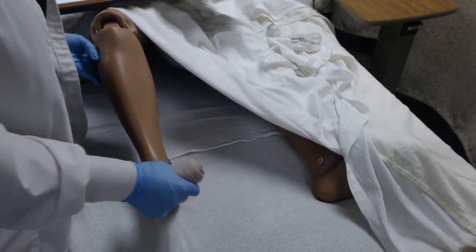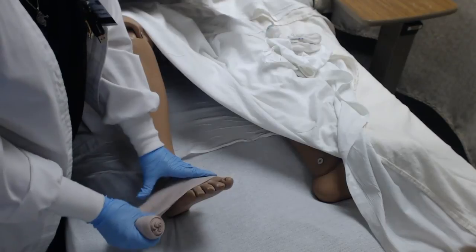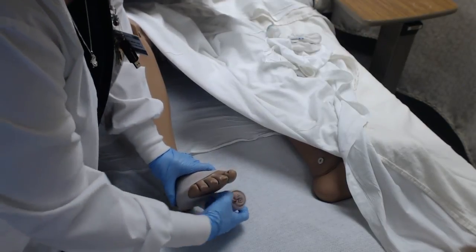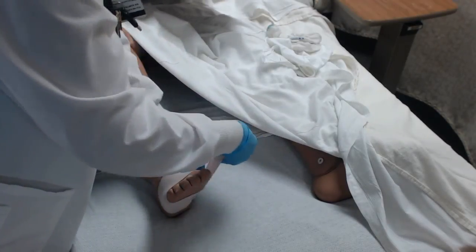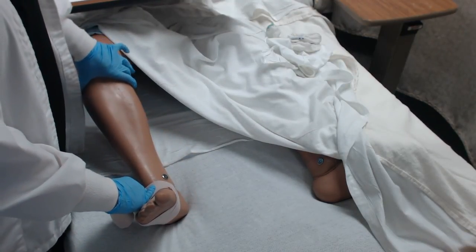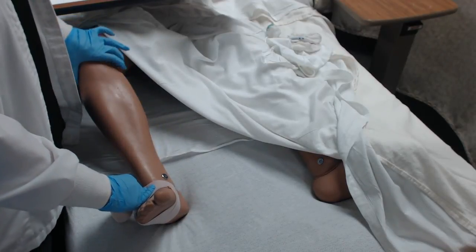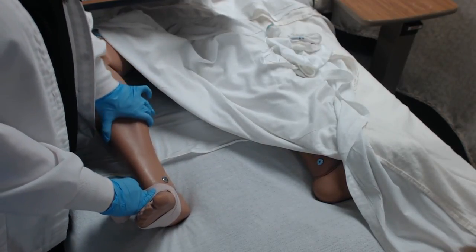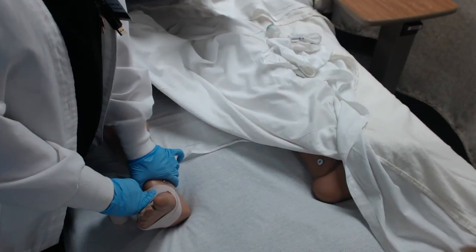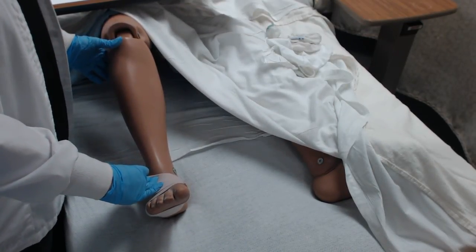So the biggest and most important thing you want to remember with ACE wraps is you're always going to start on the lower extremity, and you're going to start working your way up from there. You never want to start at the upper part of the extremity and work your way down, because you will actually cause all that fluid that was up here to end up in the foot. And that can cause harm to the patient's vasculature.